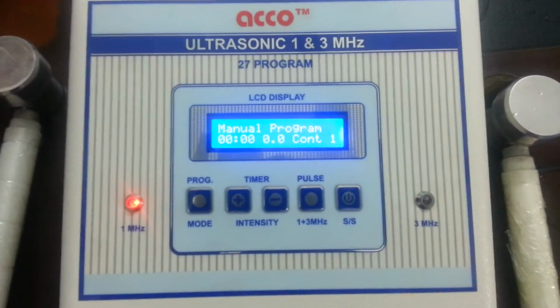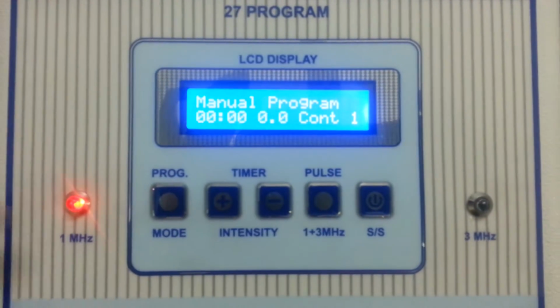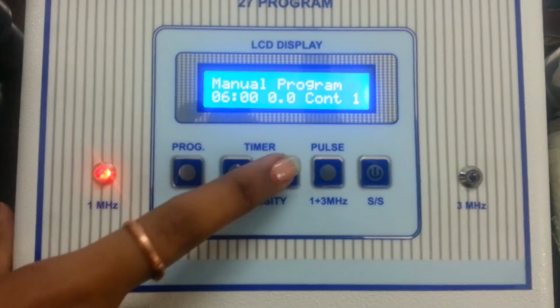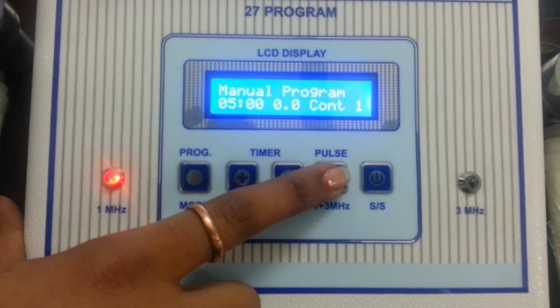Machine will start with a manual mode. You can set the details as per your need. Press mode button. Now set the timer as per your need. Timer up. Timer down. Now select the mode as per your need. Continuous or pulse.